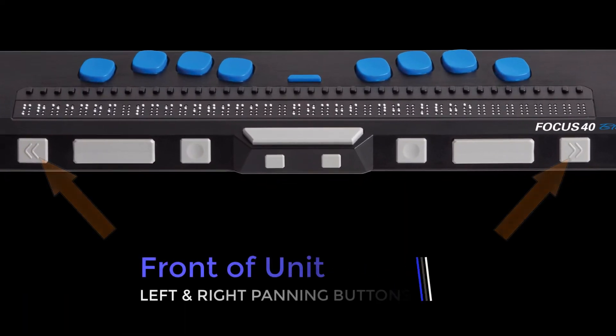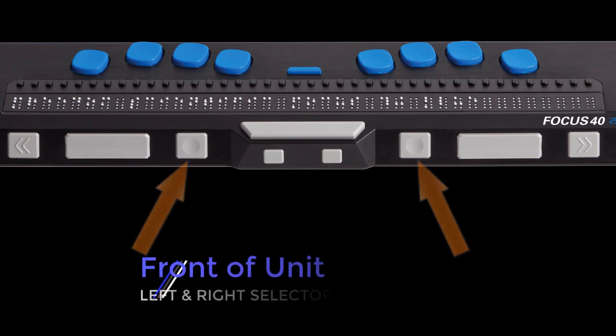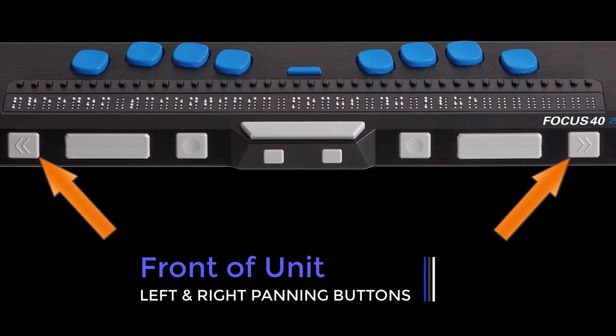On the front edge of the display are the following controls, outside to inside, though this may vary depending on your model: left and right panning buttons, left and right rocker bars, left and right selector buttons, and left and right shift buttons. The Focus panning buttons move one display width left or right when they are pressed.